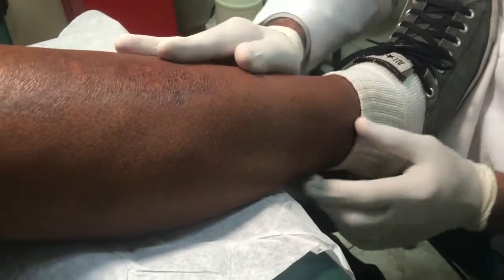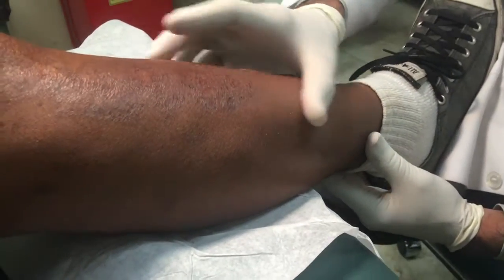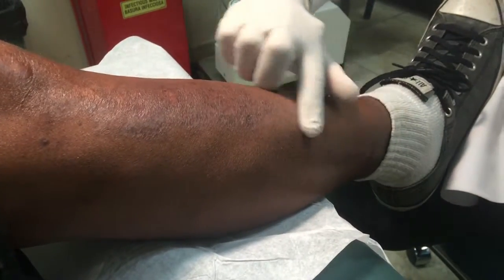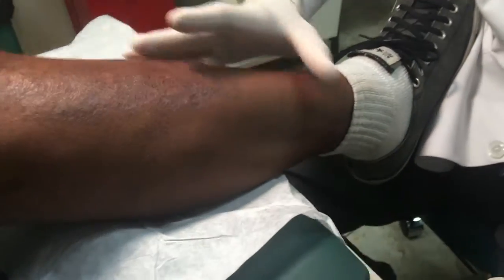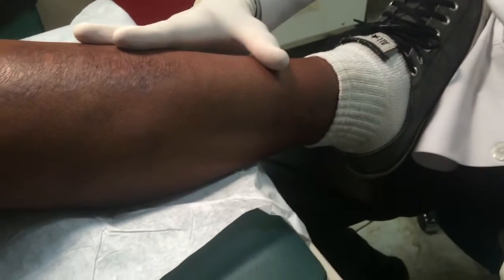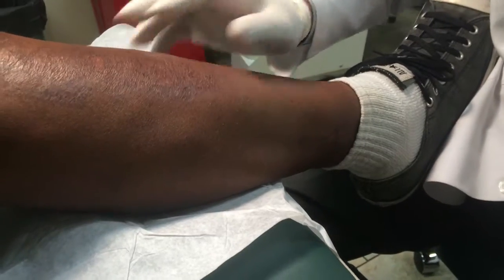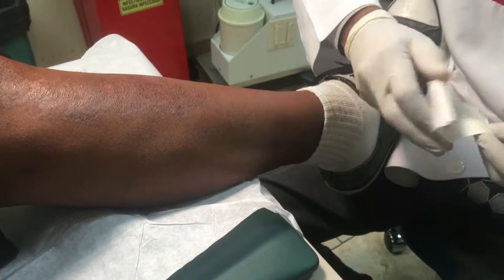This area should be cleaned properly. Ask the patient to take a shower before coming for the procedure. I'll try to use a razor to clean up the skin. Even if there are no hairs, it's a good idea to use that razor to get rid of small blonde hairs if they are there. In this case I see no necessity for doing it. However, sometimes you can miss those small fine hairs.